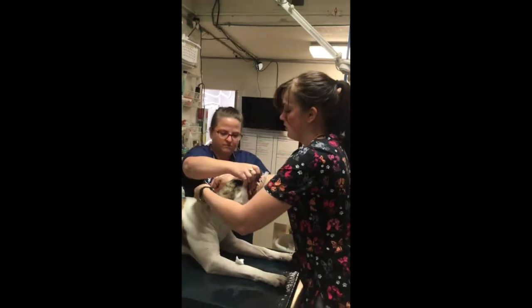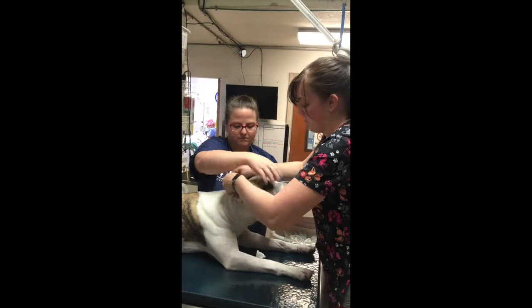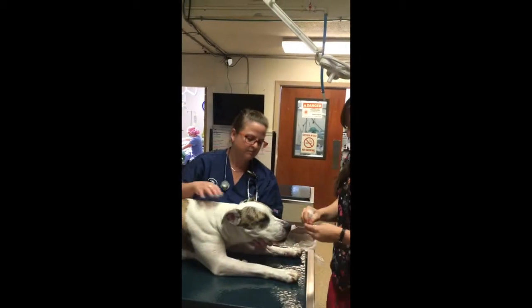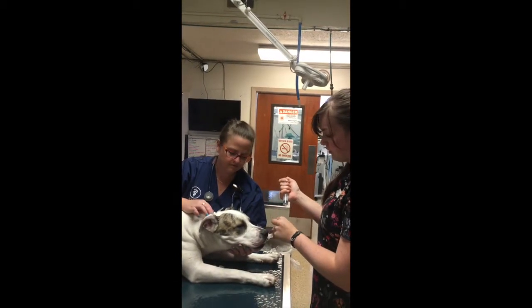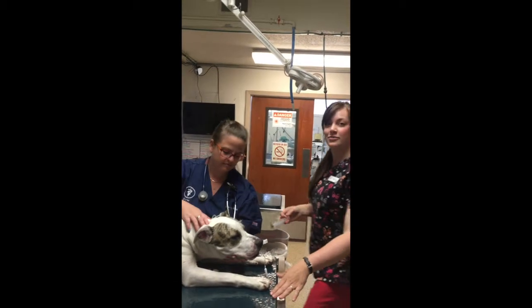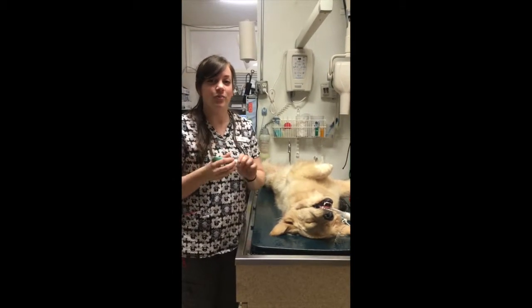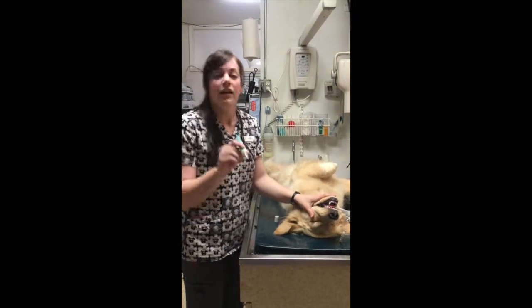I'm going to secure the tube to the patient. Once that's done, I'm going to take the cuff and put the appropriate amount of pressure inside the cuff to inflate it. That's good. Okay. I'm going to be demonstrating how to put Optixcare eye lube into a patient's eyes that is going into surgery to keep her eyes lubricated. So I have my eye lube here.